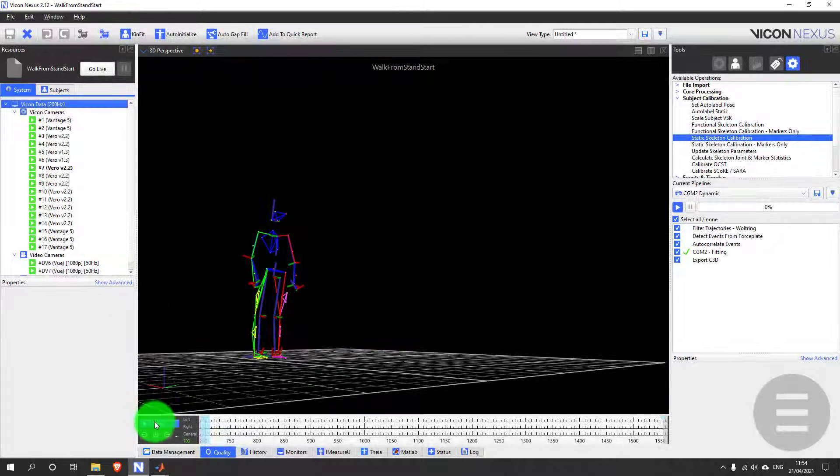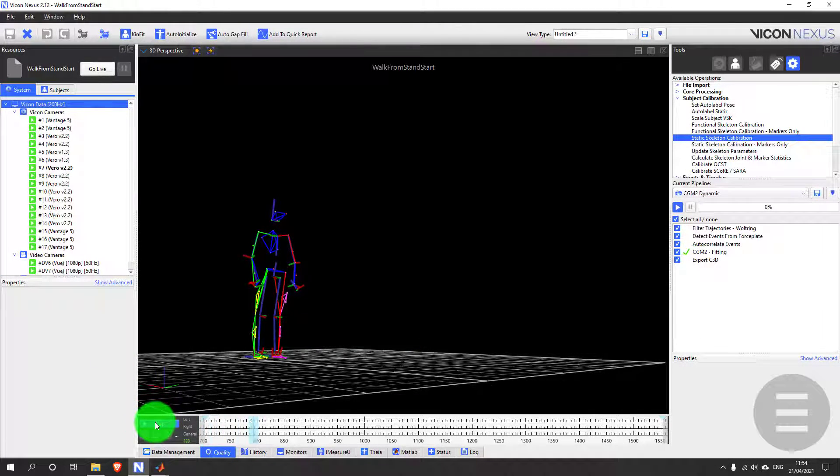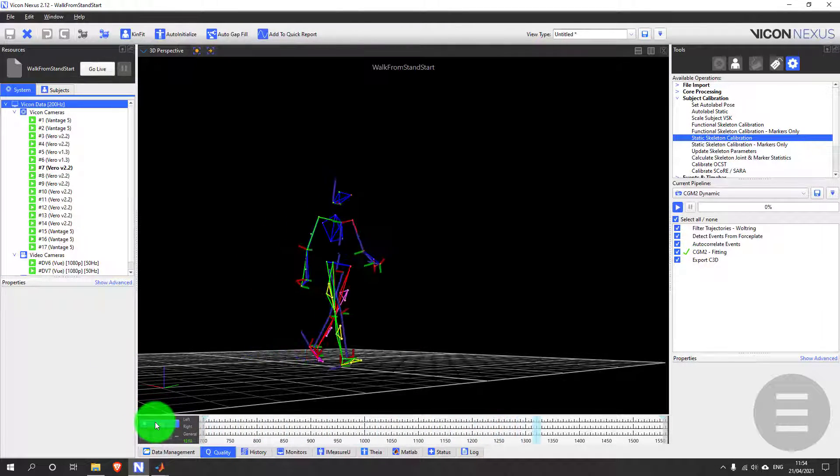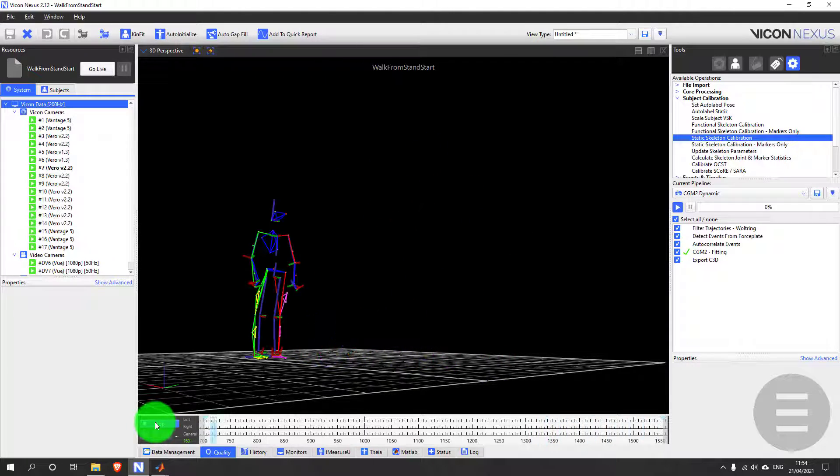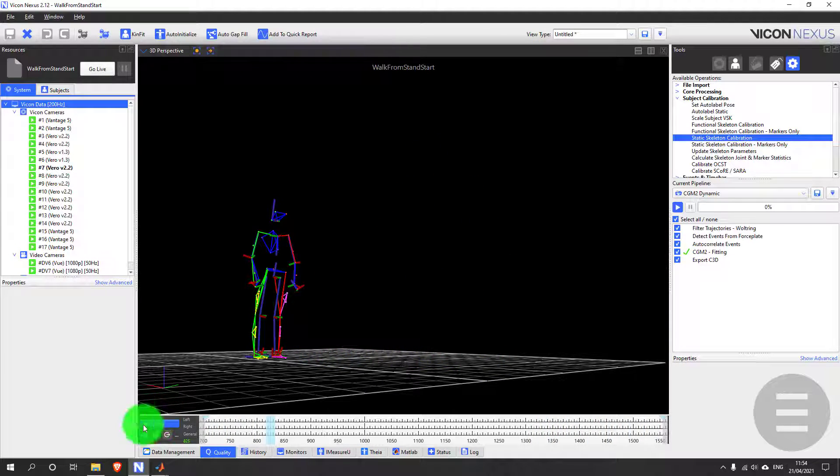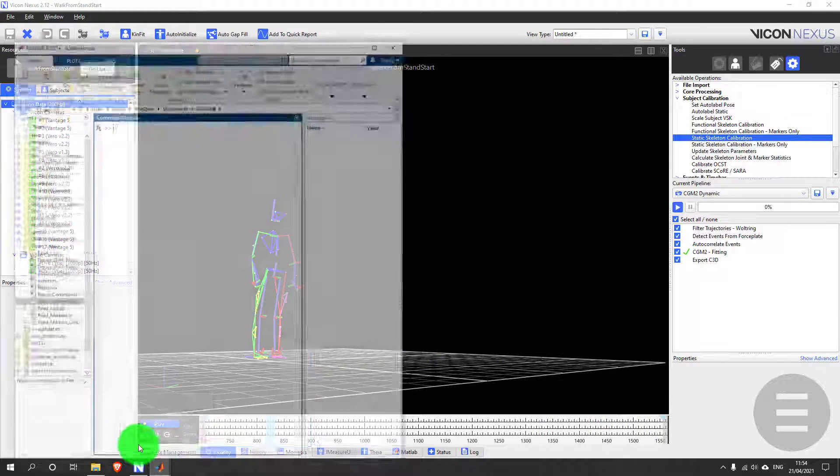Today I'm going to show you the integration between Vicon Nexus and MATLAB. Here I have a sample trial which has already been modeled using CGM 2.4.